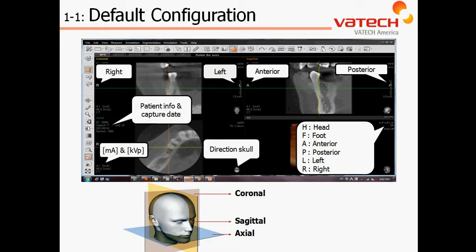What's important to understand as it relates to 3D viewing software are the three basic planes, including coronal, which is going from right to left as well as up and down; sagittal, which is also up and down but going anterior-posterior; as well as axial, which is going from right to left and from anterior-posterior.